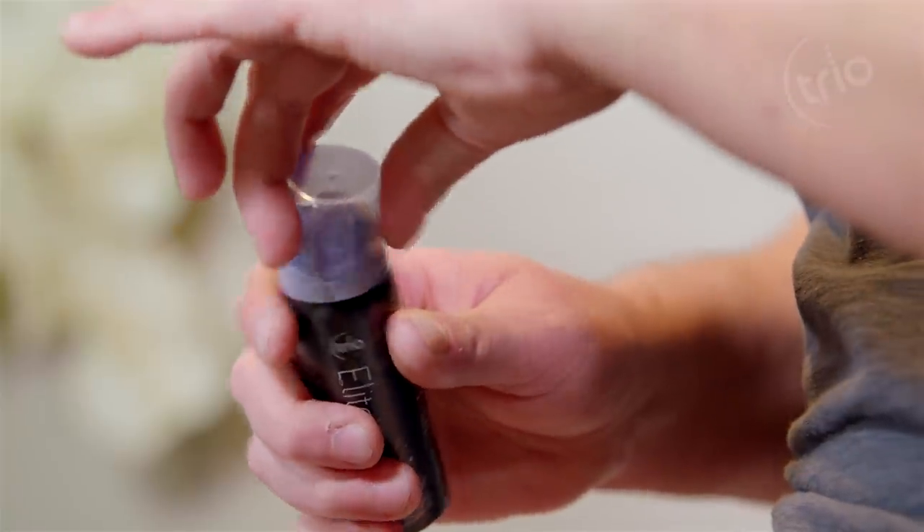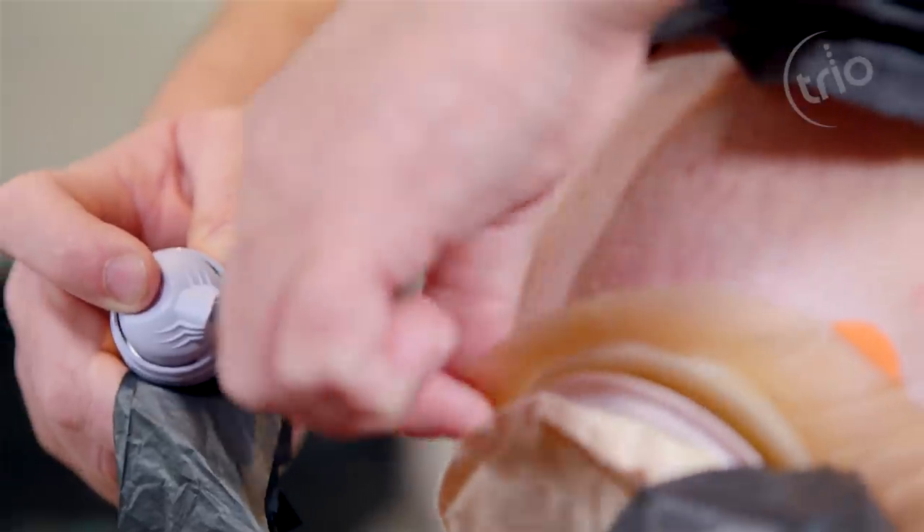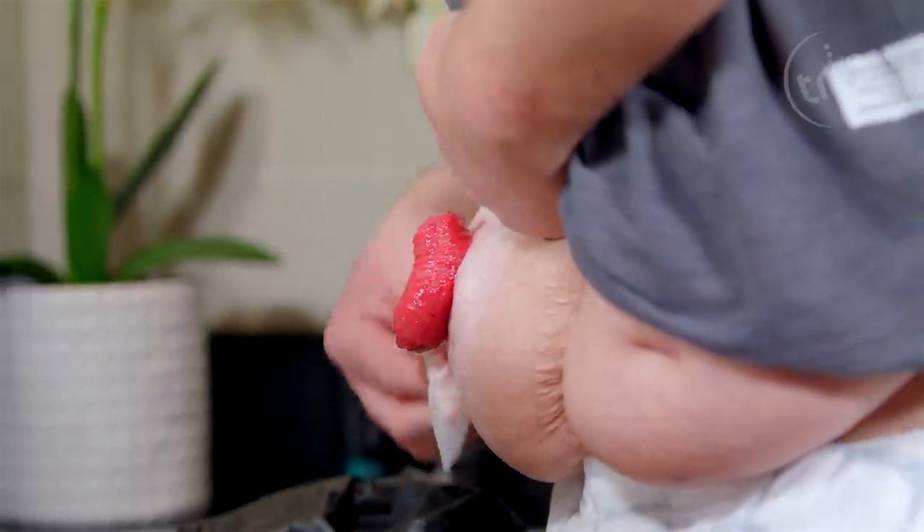Use Trio Elite to remove your pouch. Clean the area with water and pat your skin dry. The Trio Silics Flange Extender will not stick to wet skin.